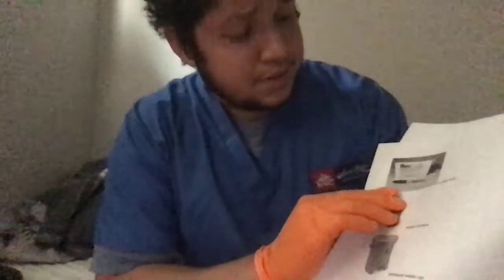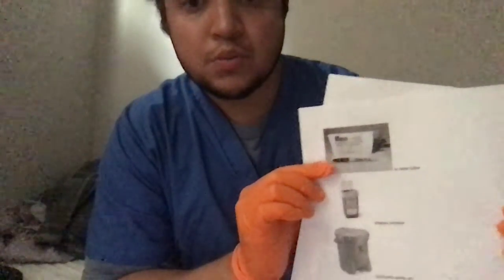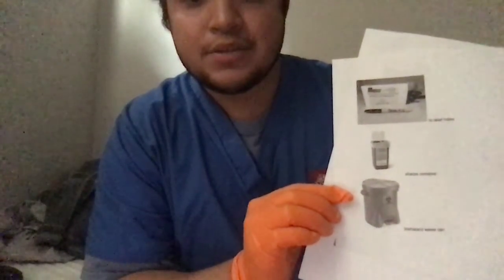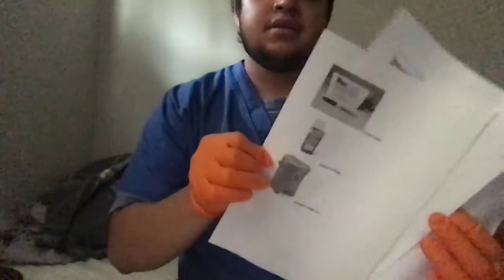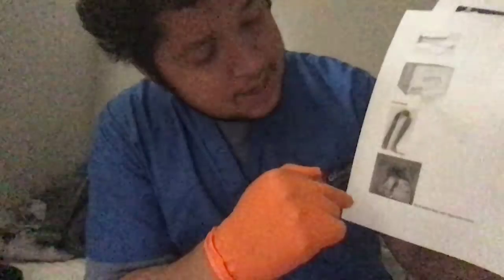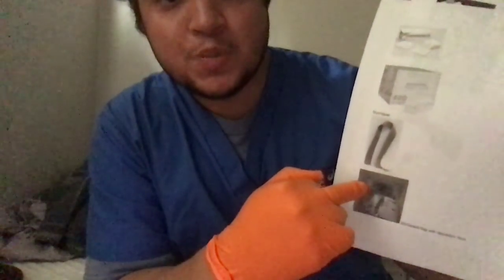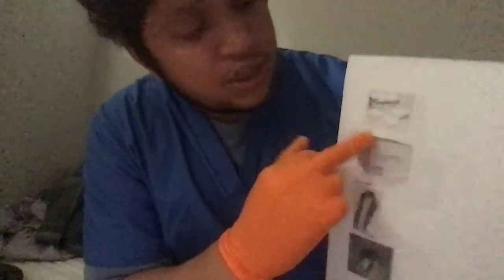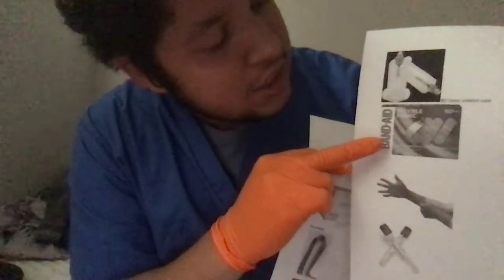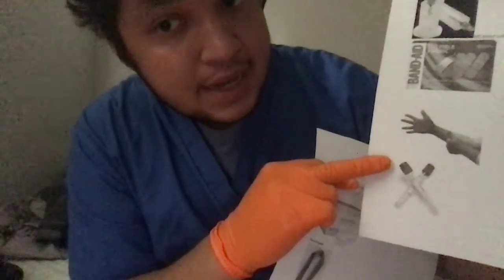After sanitizing your hands, I'll show you the materials: a Sharpie to label the tubes, a sharps container, a biohazard waste can, gloves — which you already have on — tourniquet, a biohazard bag to place your tubes in to send to the lab right after the venipuncture, gauze, alcohol wipes, BD blood collection tube, band-aid, gloves, and your tube.